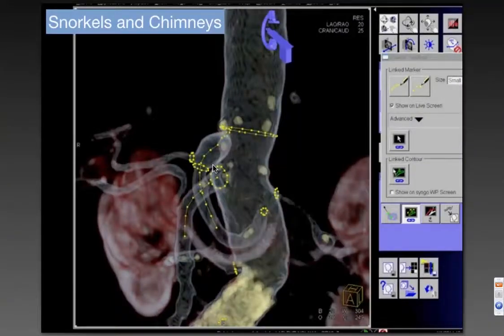Let's move on and look at more complex aortic interventions where we're putting in snorkels and chimneys — a patient who had a previously placed endograft that is almost flush with one of the renal arteries. On the workstation, this is how we plan those operations.